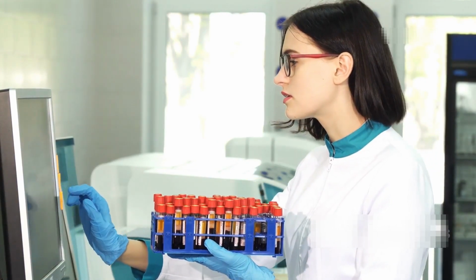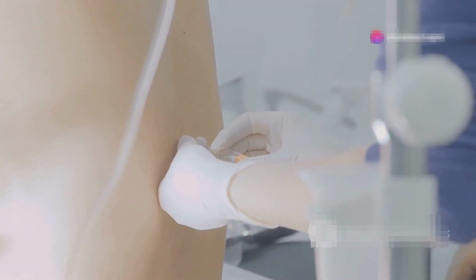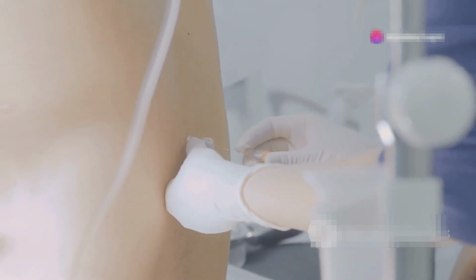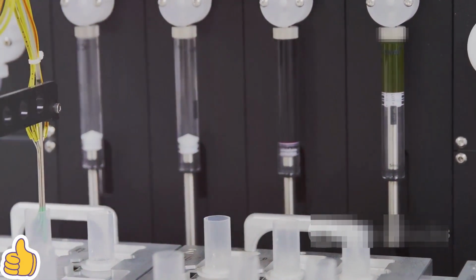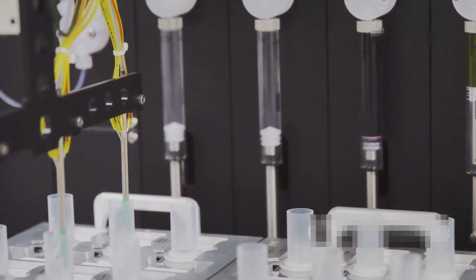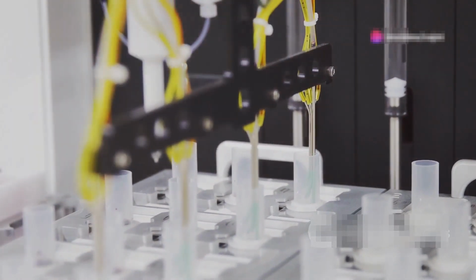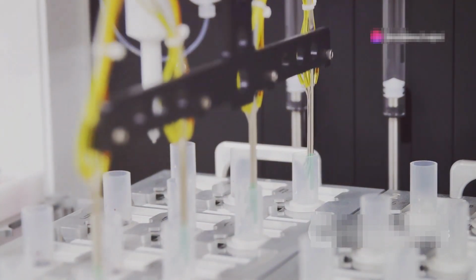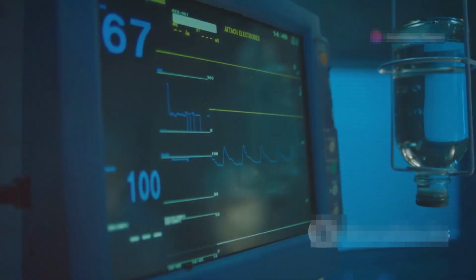Alright, let's break down how this machine works. You draw a blood sample, usually from an artery, and the analyzer runs it through various sensors. These sensors measure different components like pH, partial pressure of oxygen, PO2, partial pressure of carbon dioxide, PaCO2, bicarbonate, HCO3, and oxygen saturation, SaO2. Each of these parameters gives you a snapshot of the patient's blood gas status.